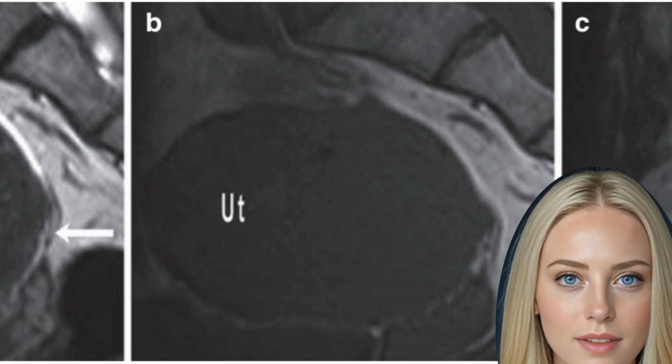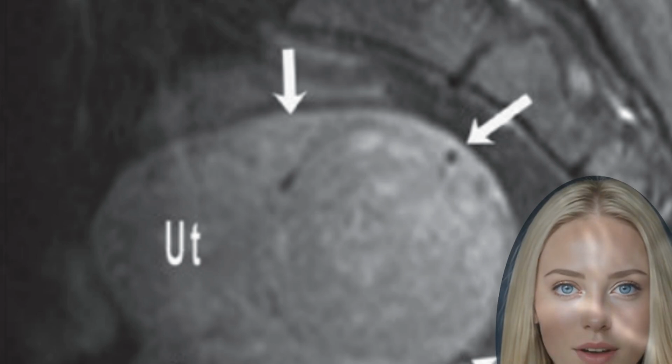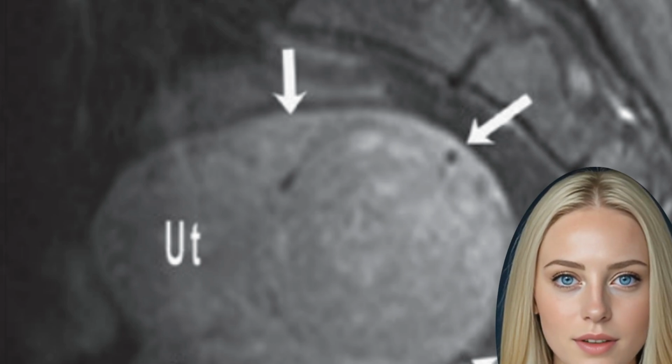Angulation of the MR sequences to the uterine corpus is essential for correct visualization of the sacrouterine ligament, the torus uterinus and the fornix vaginae. Slice thickness should not exceed 3 to 4 mm for detection of small implants. There is no indication for CT performance in endometriosis.